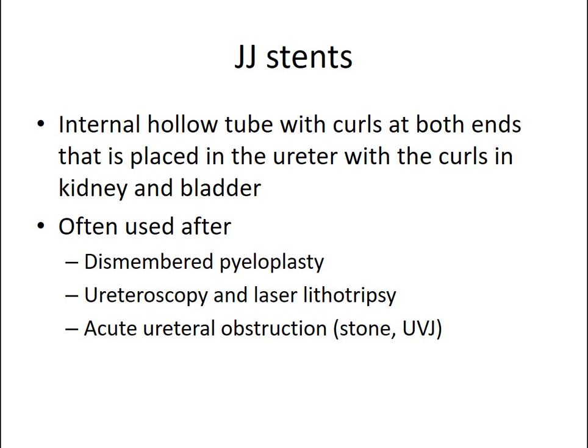We use these when we do pyeloplasties to allow for good drainage of urine through the anastomosis when we anticipate there's going to be some swelling postoperatively, as well as keeping that area open to minimize urinary leakage.